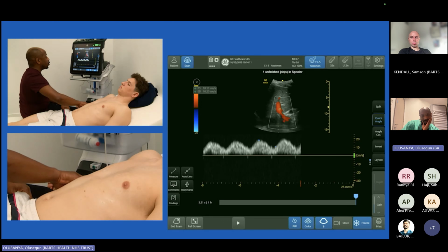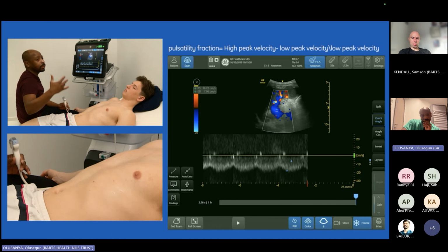So in the normal patient, what has been described is that the flow in the hepatic, portal and splenic veins, when there's no congestion, is nice and linear. As you start to get more and more congested, you start to see an increase in pulsatility. A pulsatility of less than 30% is considered normal. As you start to get above 30%, this is considered significant for pulsatility, especially when considered in the light of an abnormal hepatic vein and an abnormal IVC. So here we have pulsatility that's less than 30%. I can measure the pulsatility index, but I'm not going to demonstrate that for these purposes.